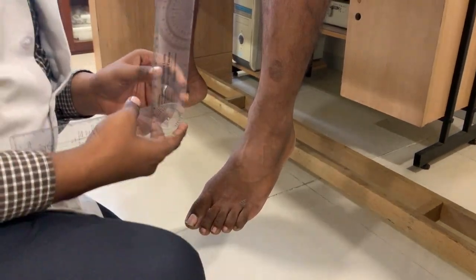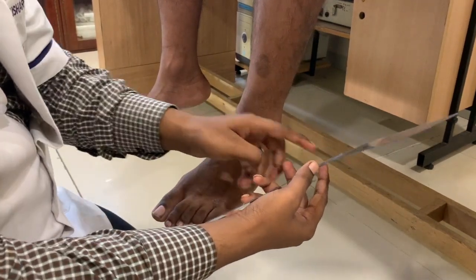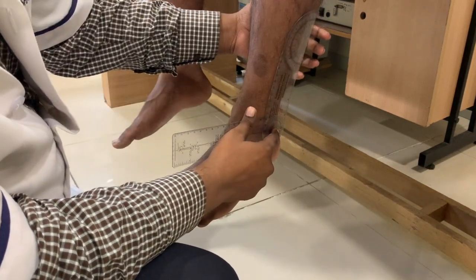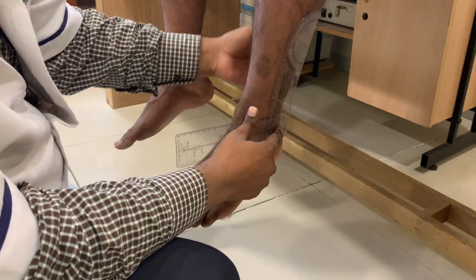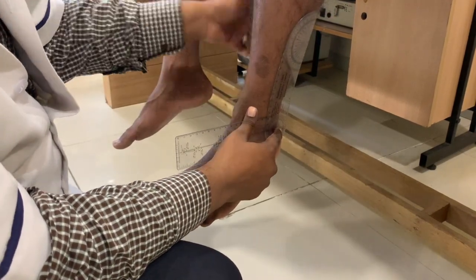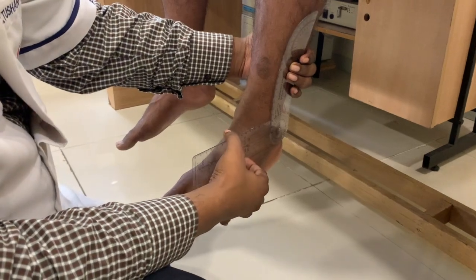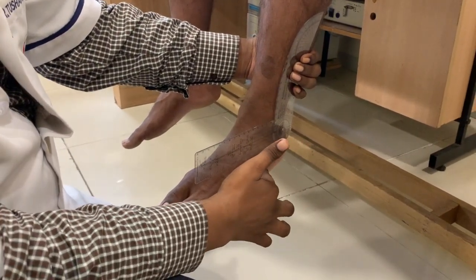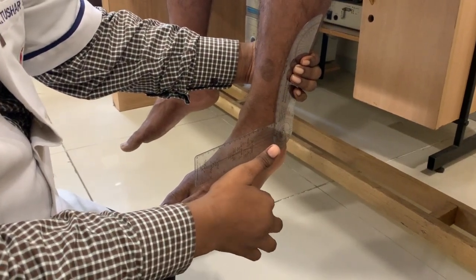To check the range of motion, we keep the fulcrum at the lateral malleolus and the stabilizing arm at the lateral aspect of the leg, pointing towards the lateral epicondyle of the femur, and the movable arm is parallel to the lateral aspect of the fifth metatarsal.